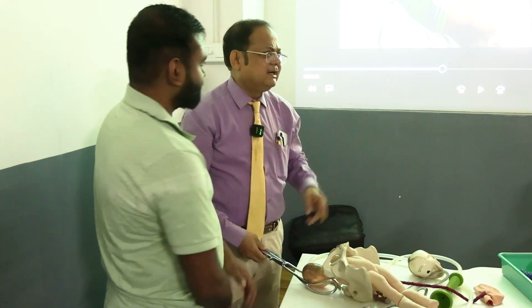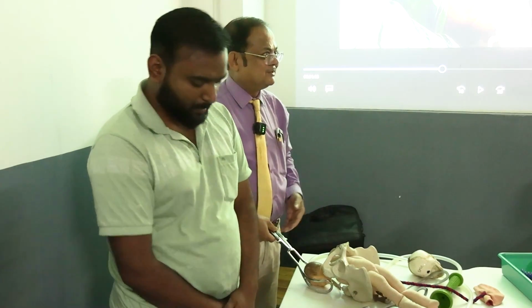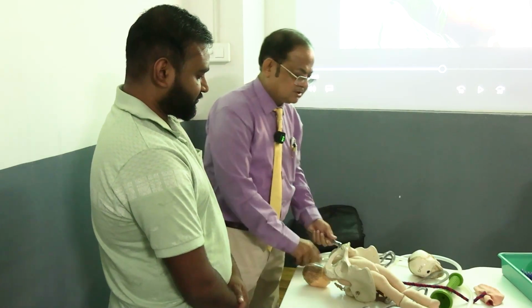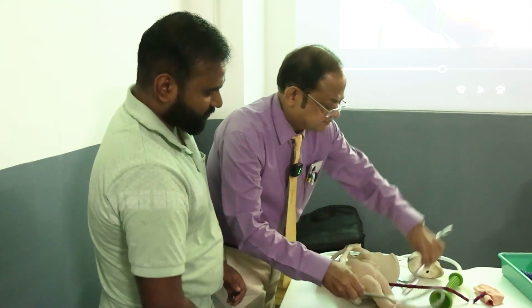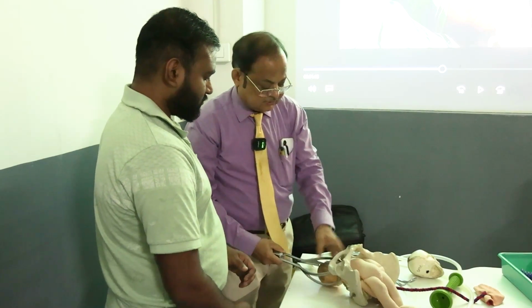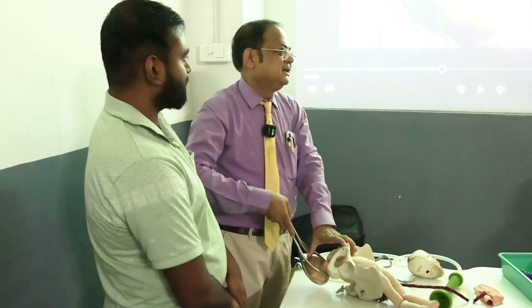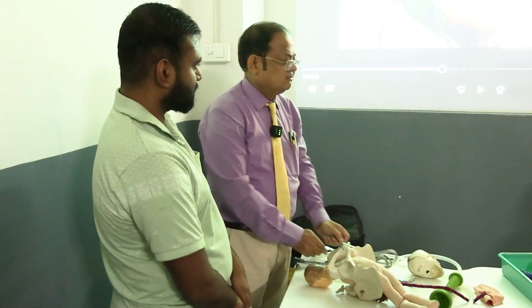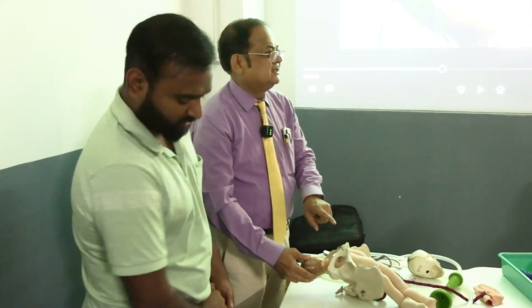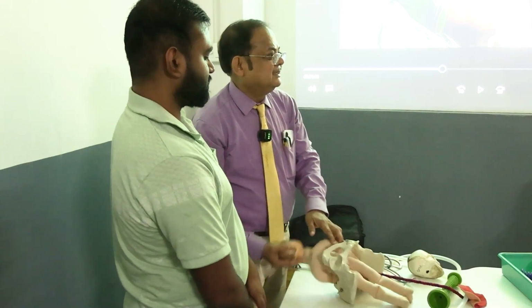So there are three movements, but in case of outlet forceps, it is already in the perineum, the subocciput is already below the symphysis. So backward traction is not required. Two tractions: one is horizontally downward, and then forwards and upwards. And the forceps are opened, and restitution, external rotation, anterior shoulder under the symphysis, posterior shoulder delivered, and the trunk is delivered by lateral flexion like this.